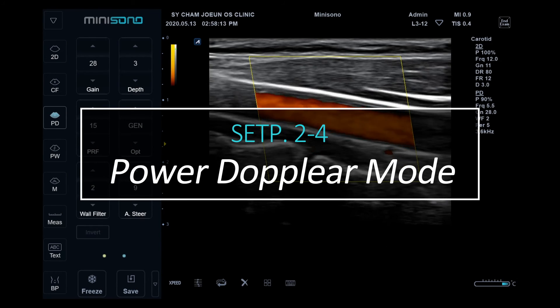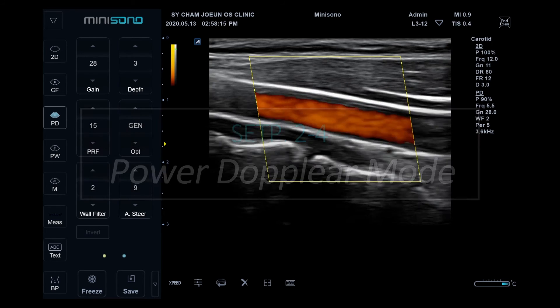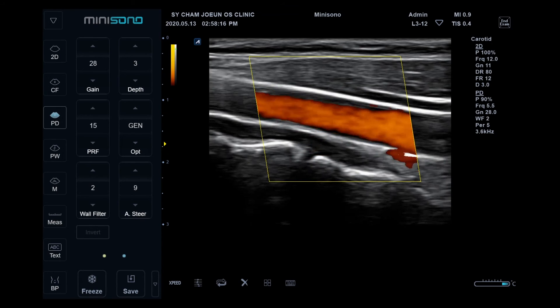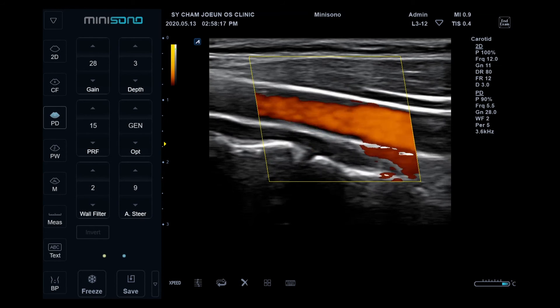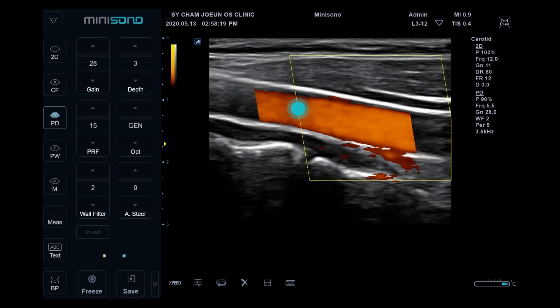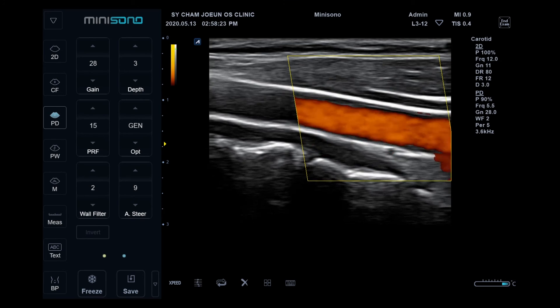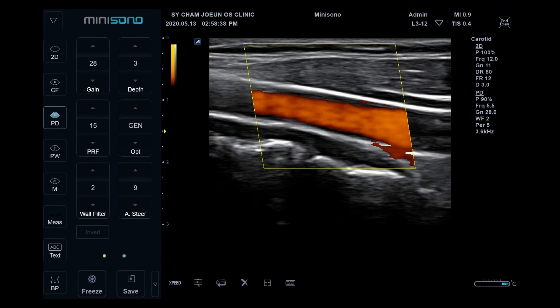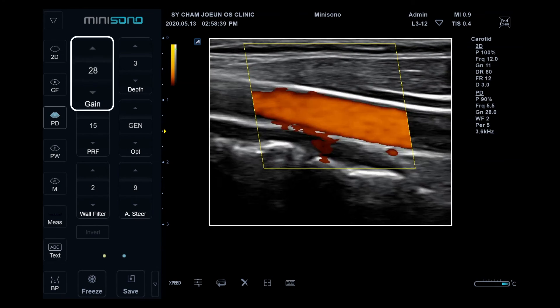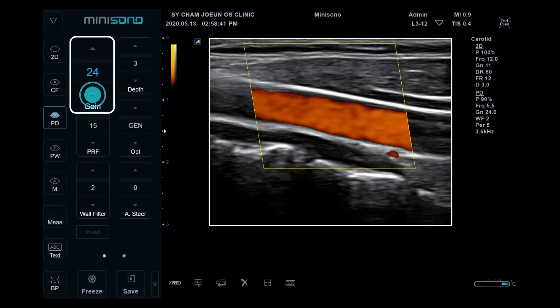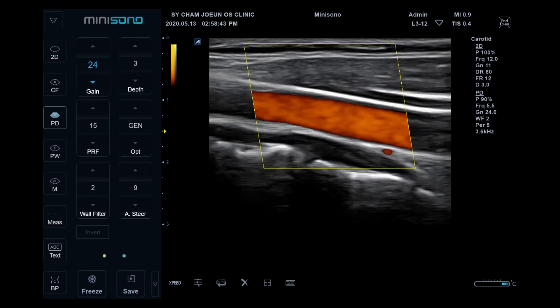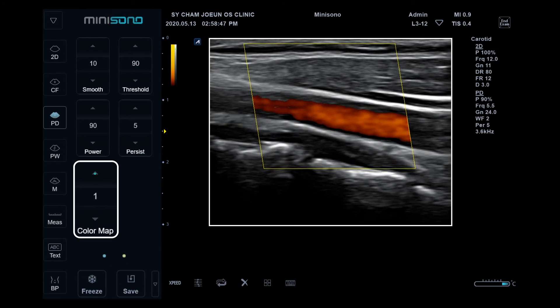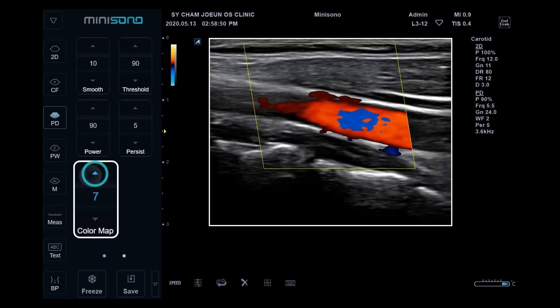Power Doppler mode: tap the PD button. Move the ROI box and adjust its size by tapping the outline. On the control area, you can adjust gain. If you want to use DPDI, change the color map to 8 or 9.